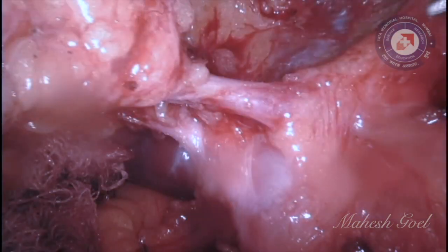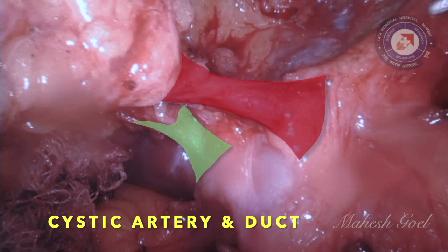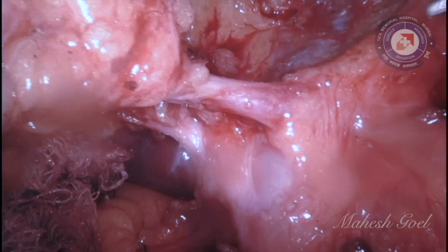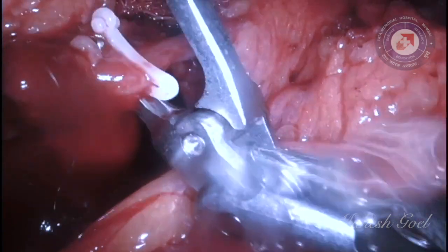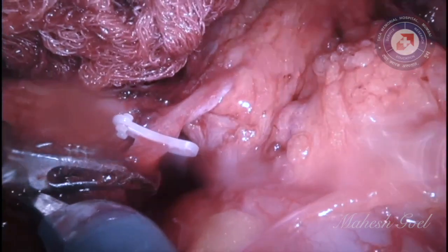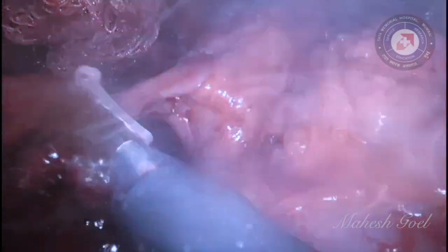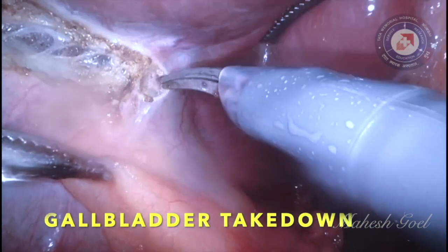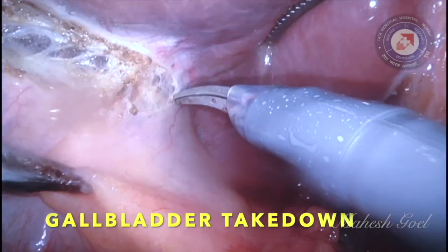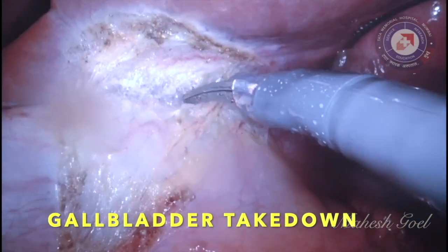Once the cystic duct and the artery are dissected, the cystic artery is ligated and divided. The gallbladder is then detached from the undersurface of the liver, exposing its fossa.